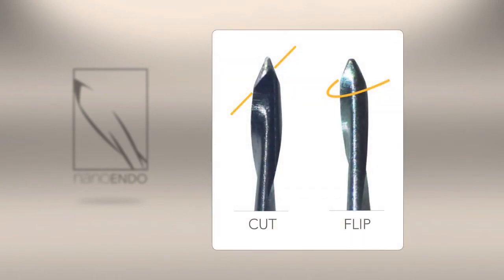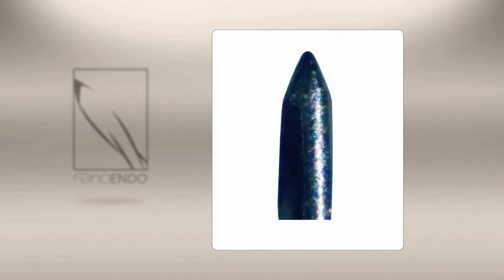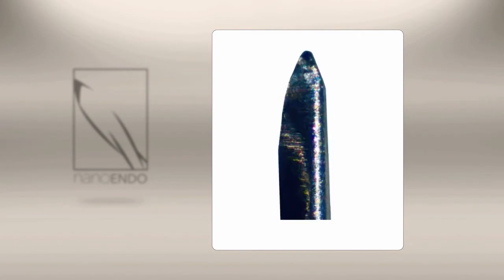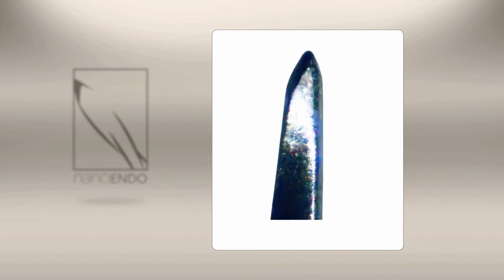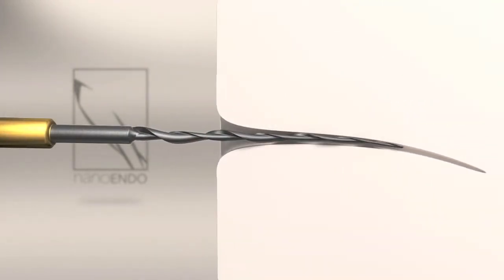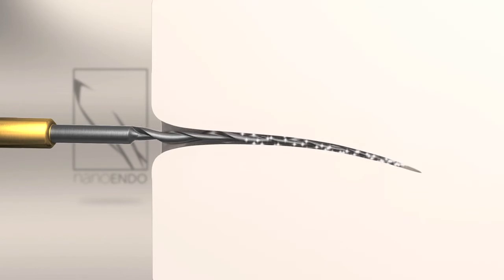At its tip, one flute extends through its end, creating a kind of cut-flip tip. Functioning much like a spoon with a sharpened edge, it effectively forms dentinal chips on one side, while the opposing side's curved surface acts as a self-guiding pilot. This allows the 1ENDO file to navigate even the most serpentine canals without screwing in or pushing debris in advance of its tip or through the apical foramen.